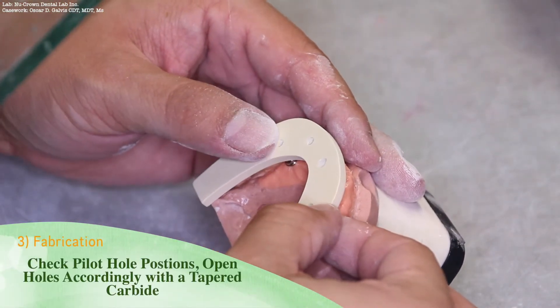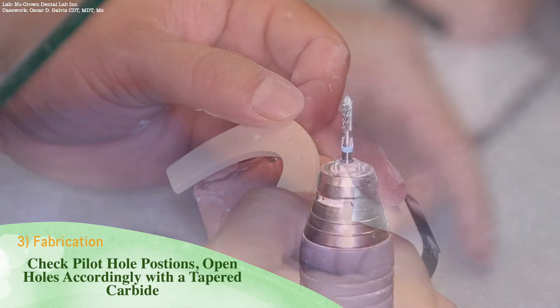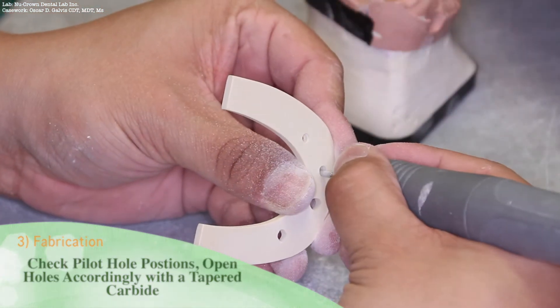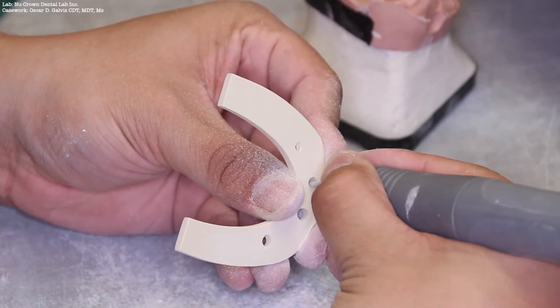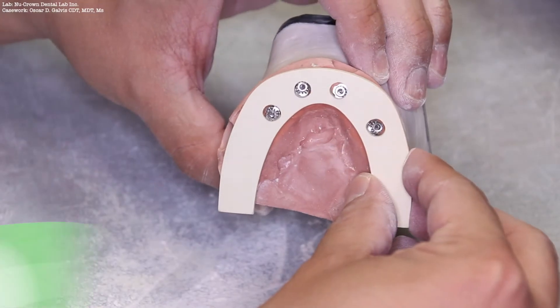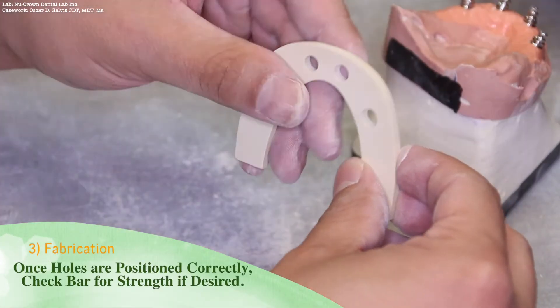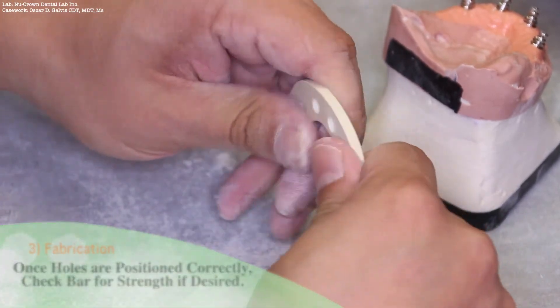Check the pilot hole positions and open those holes accordingly with a tapered carbide burr. Once the holes are positioned correctly, even checking the bar for strength, the Trilor still holds up.